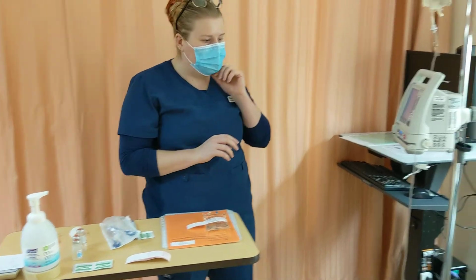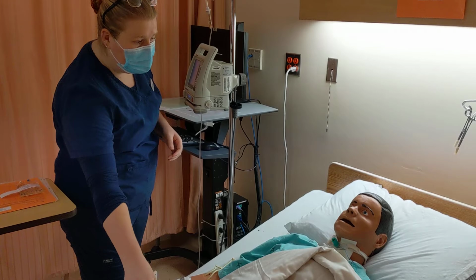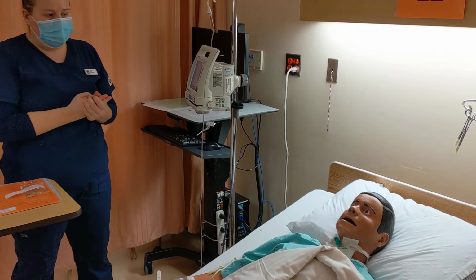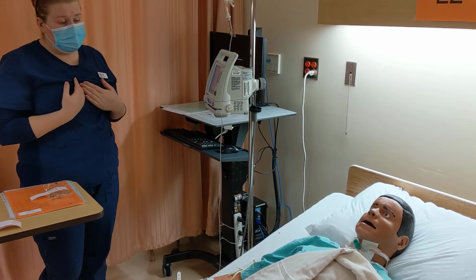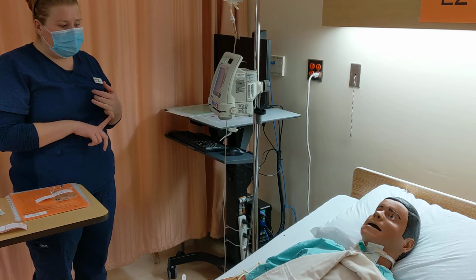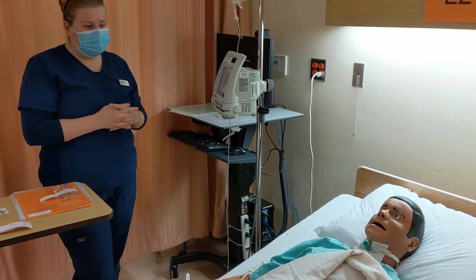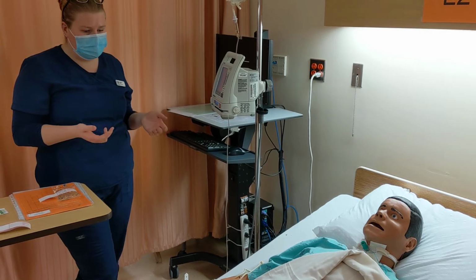After I've done all that, I'm just going to go back to the patient and explain the procedure. They're getting this medication for their cellulitis. It's an antibiotic. I'm going to ask them if it's okay that I give them this medication. They say that it is fine, so that's the right to refuse. I'm going to explain a couple of side effects. Wheezing and pruritus were a couple of the side effects listed on the PDM. If they have any issues with those, they can call me back and we can reassess them.